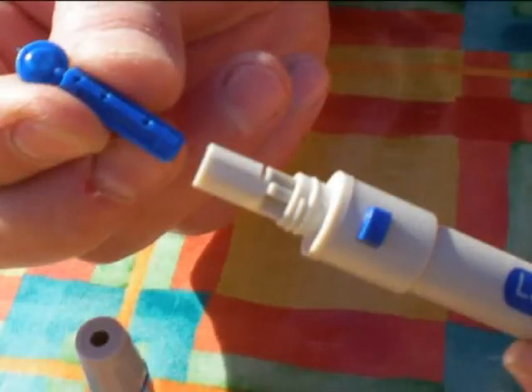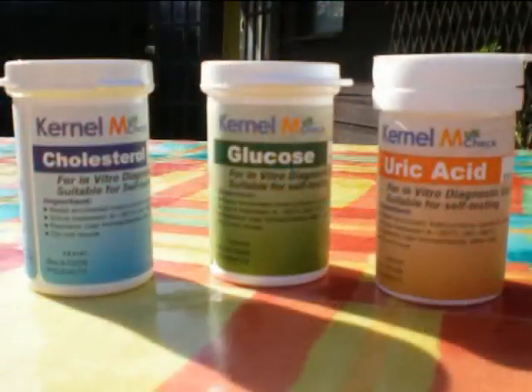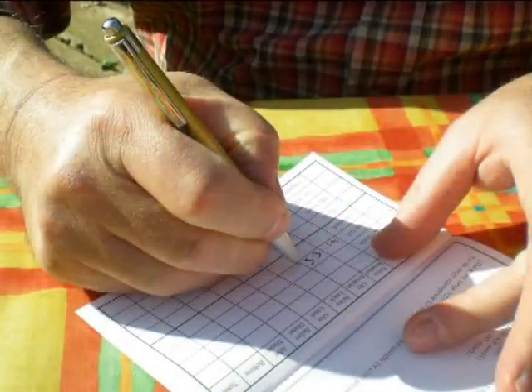Once you have completed the test, it is very important that you dispose of the waste carefully, placing the protective top back on the lancet capsule before discarding it in an appropriate container with a lid. To switch the meter off, simply remove the test strip and dispose of it. The process is the same for whichever test you choose to take. Simply make sure you place the appropriate chip in the machine and use the matching strips. Record the reading in the logbook to keep track of your progress.